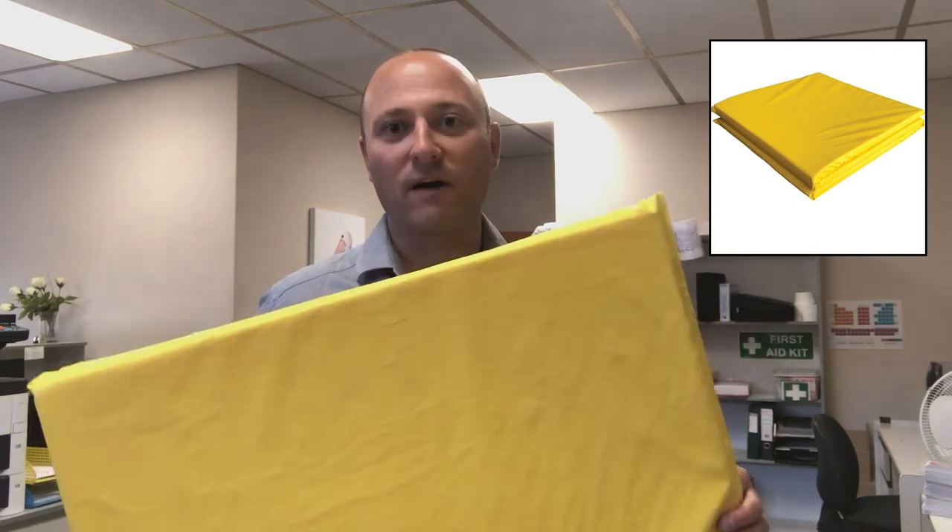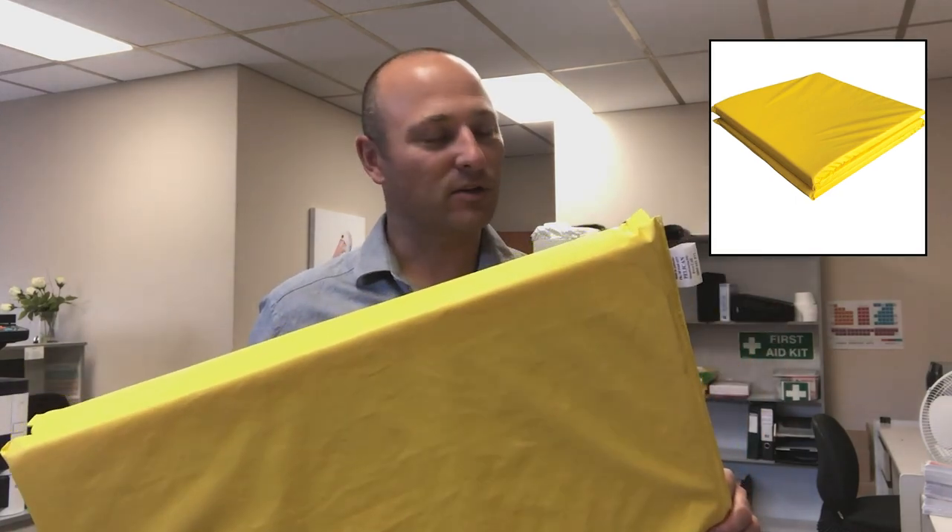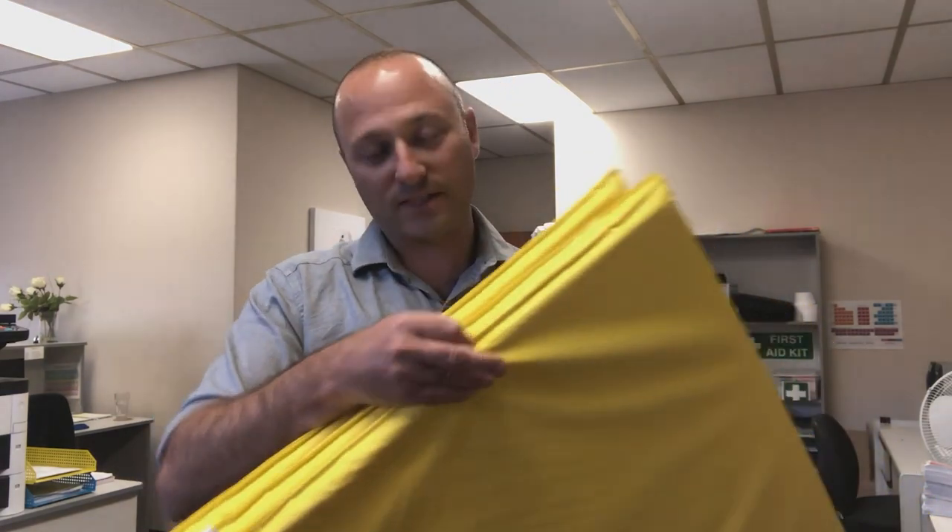We're using a high visibility yellow material so we don't have to put high-vis tape on the edges, which we do with our other bed formats.